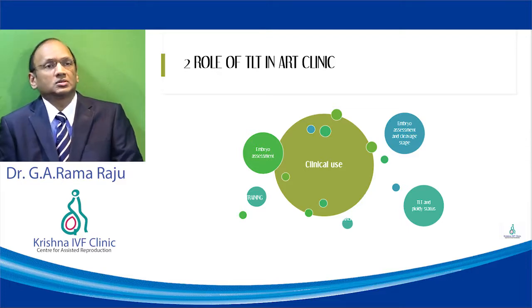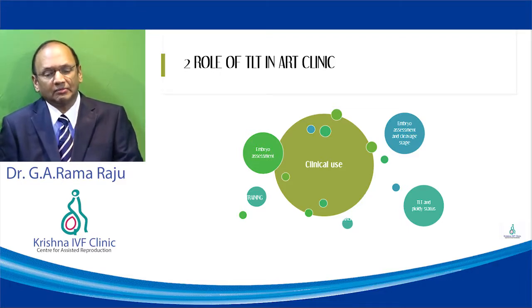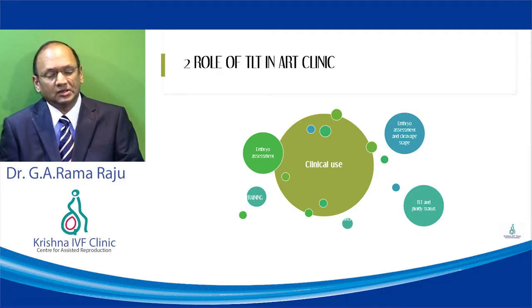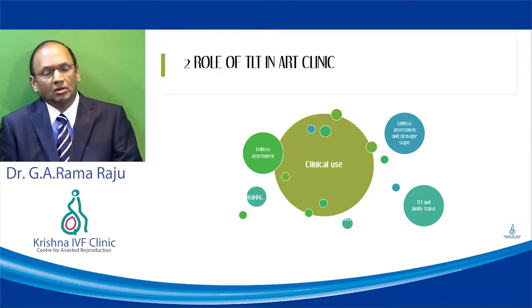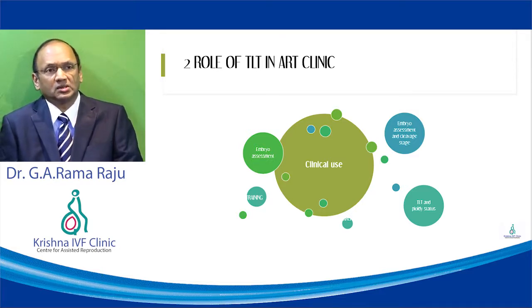It is also used to train the embryologist so that there is less observation bias, and an average embryologist can become a top class embryologist with the use of time lapse technology. And the other area is there is a whole world of opportunities to do research in the area of time lapse imaging, because it is still in the nascent phase.